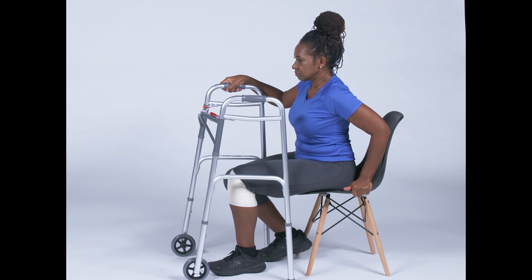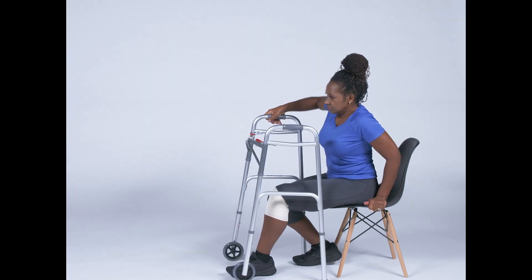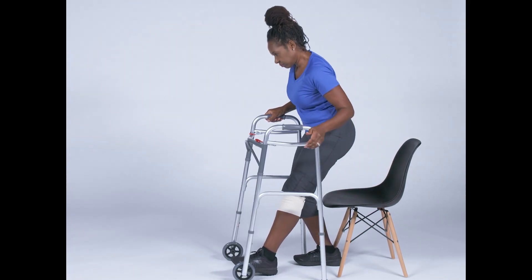Slide your non-surgical leg back — you will use this leg to help push you out of the chair. Slide your surgical leg slightly out in front of you. Push up using your arm that is on the chair and using your non-surgical leg.